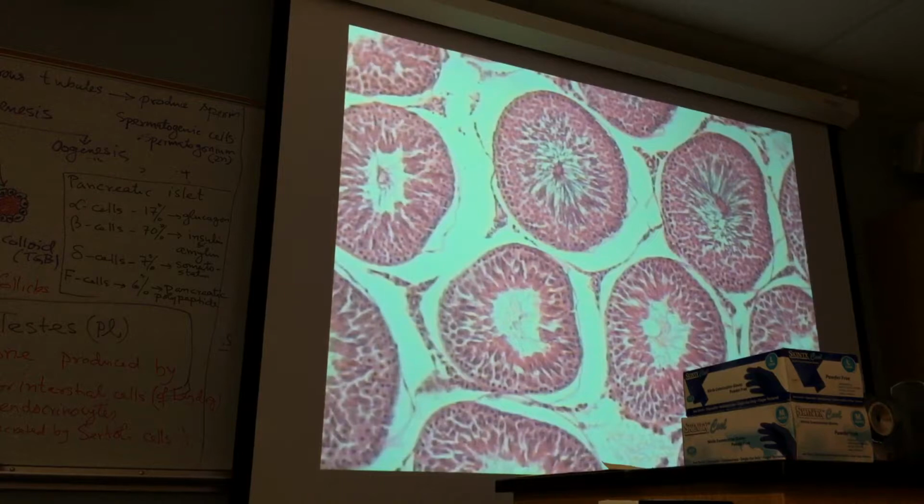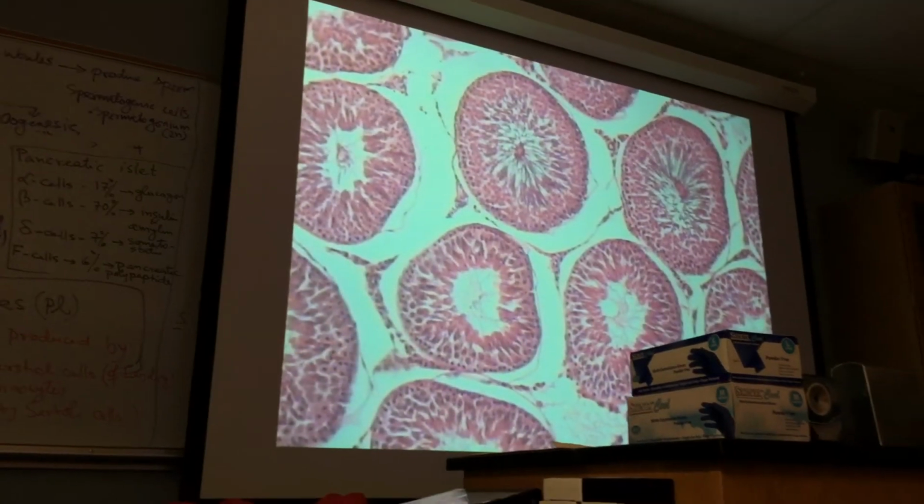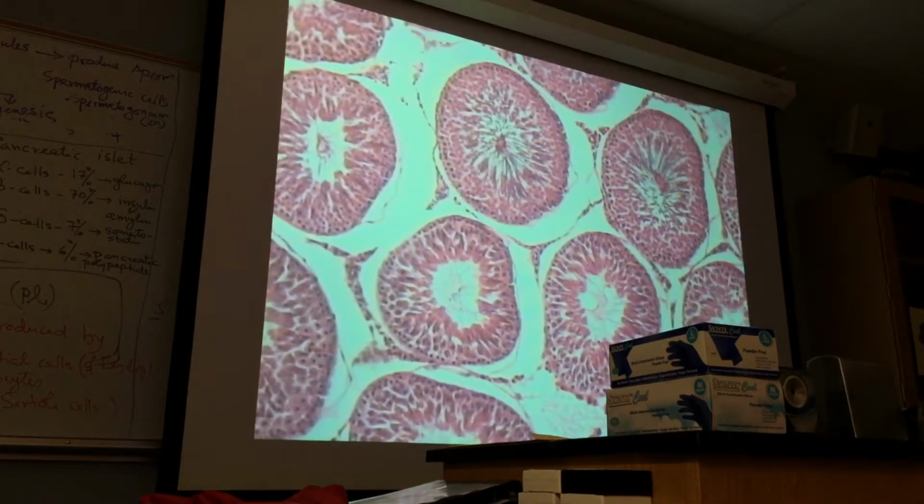Okay, so yeah, Katrina? So the only ones that we can really tell which stage they're at would be the spermatogonium, the one at the very beginning. So you can't really tell which one's which on the other ones? Naturally, as you go near the lumen, the cells will be more differentiated. Okay? As you come back, they will be more undifferentiated.